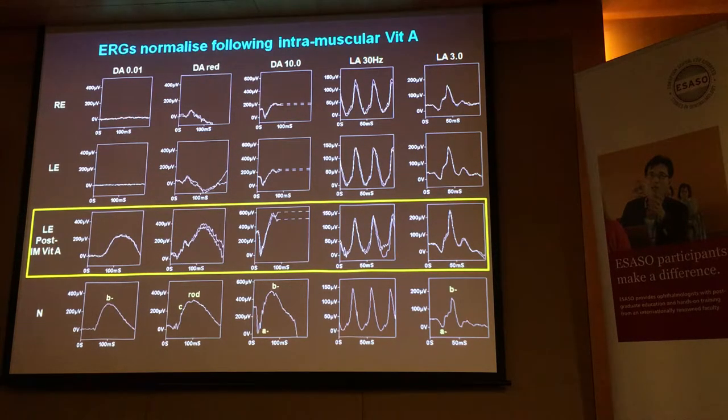So understanding the pathophysiology of the disease, rod-cone dystrophy, making sure that the technician knows appropriately, doing tests to ascertain the origin of the bright flash A wave, which here is coming from cones, not from rods. You make the diagnosis, you treat the patient, and everybody's happy, particularly the family who are expecting their kid who's night blind to have the diagnosis of RP, because that's what's in the rest of the family.